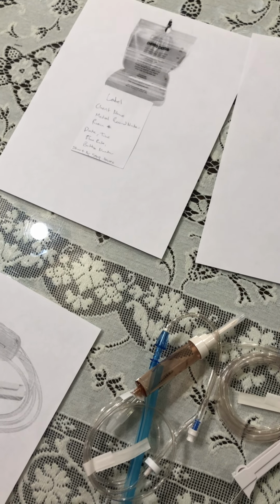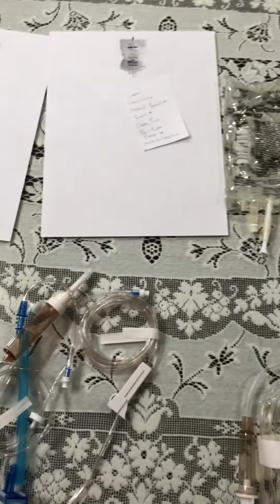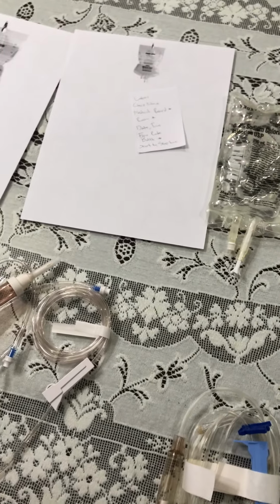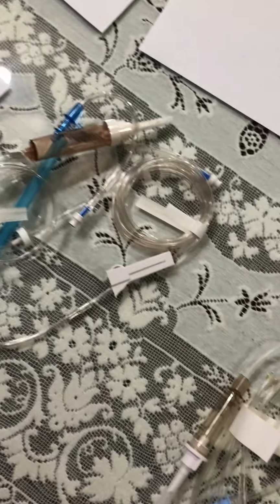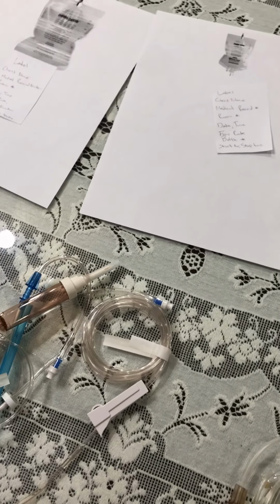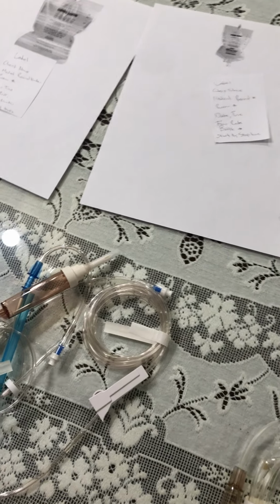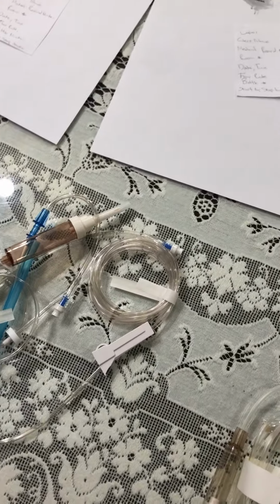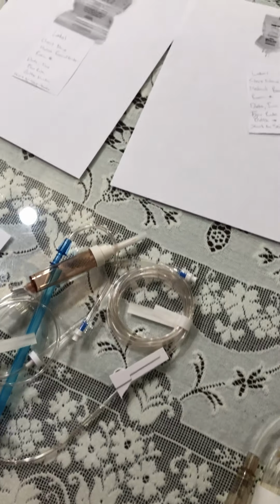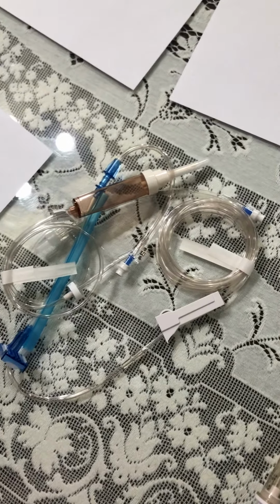So lastly, I want to do my checks after I have the TPN solution up and running. I want to make sure I change the filter and the IV lines every 24 hours. Change the tubing and solution every 24 hours. I also want to thoroughly clean the port according to protocol, like the central venous access device. I want to label my tubing as well with the date, time of usage, and my initials.